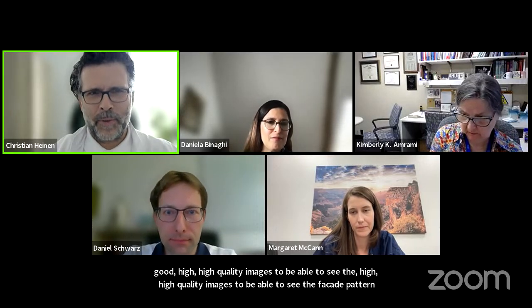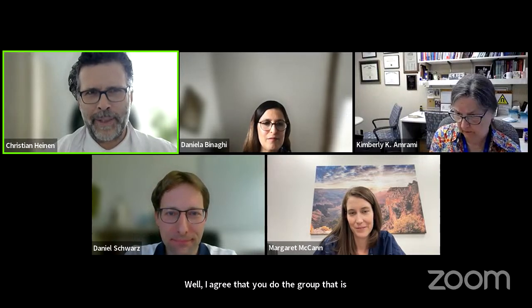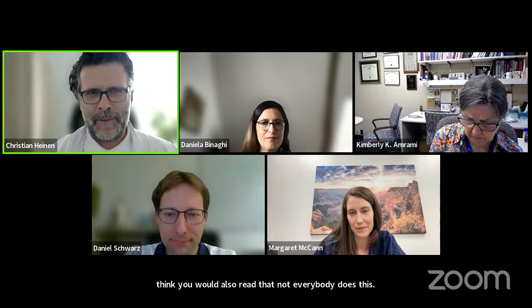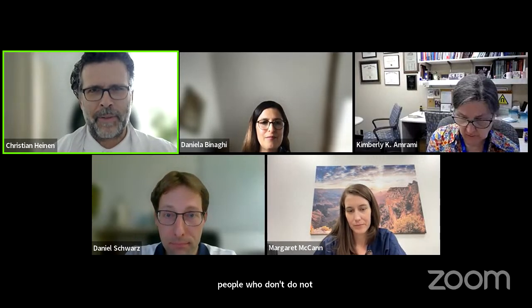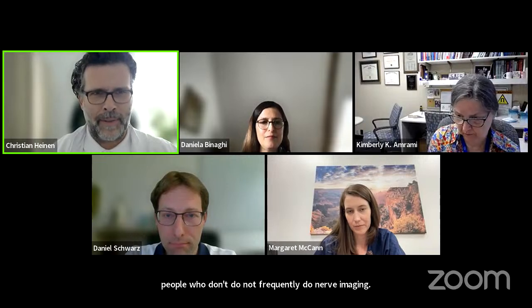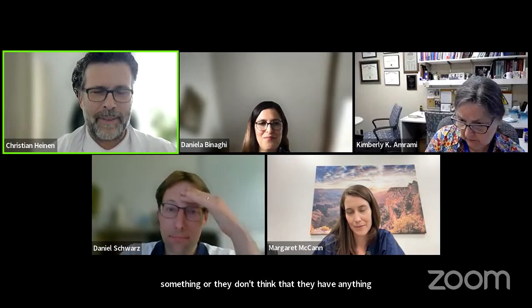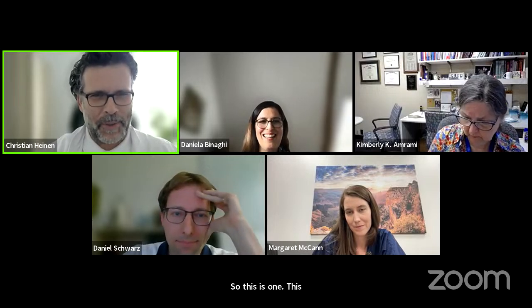Well, I agree that you do, the group that is here, but I think you would also agree that not everybody does this in this meticulous way. So we have a lot of reports from people who do not frequently do nerve imaging, talking about T2 hyperintensity, and what happens is that all the patients go crazy because they think they have something, or they think they don't have anything. So, well, we will not solve this problem today, this is for sure.